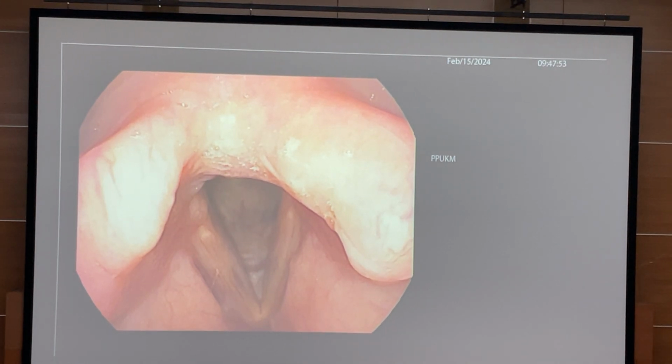For those sitting for exam, don't just do drone examination. Drone meaning you put the camera at the tip of epiglottis and say, okay, it's normal. We wouldn't put any normal cases in the exam. There must be some findings. So you put it at the tip of epiglottis just to see the panoramic view and to assess the mobility of the vocal fold. And when you're happy with that, you have to go near to see any structural abnormality.